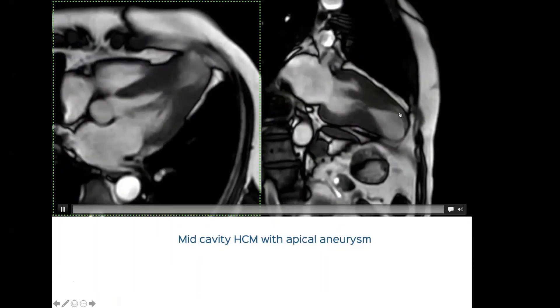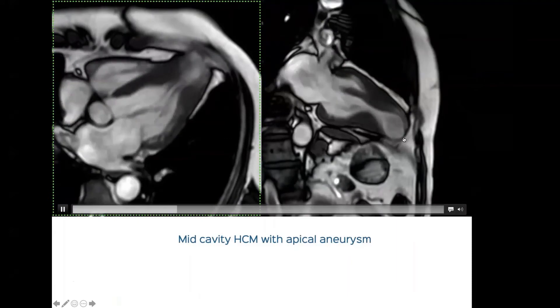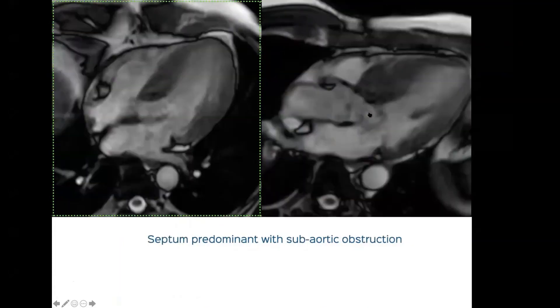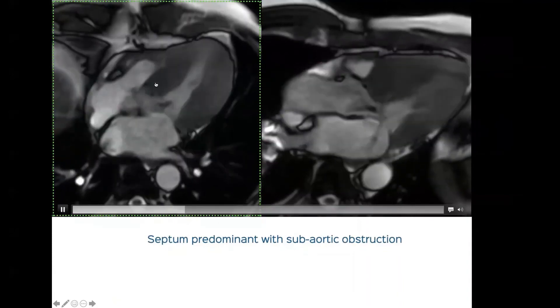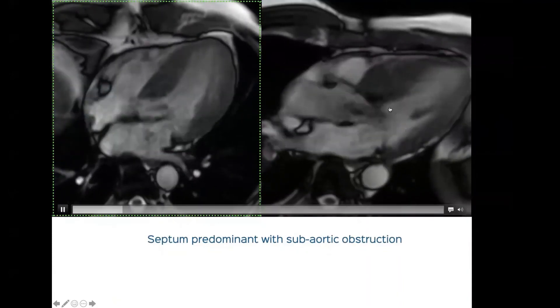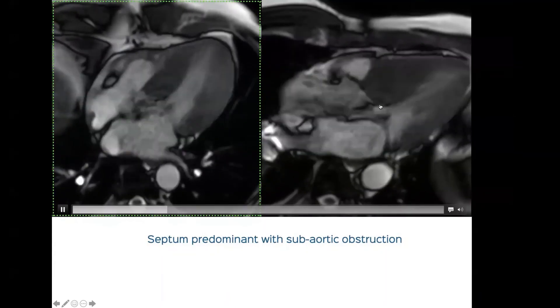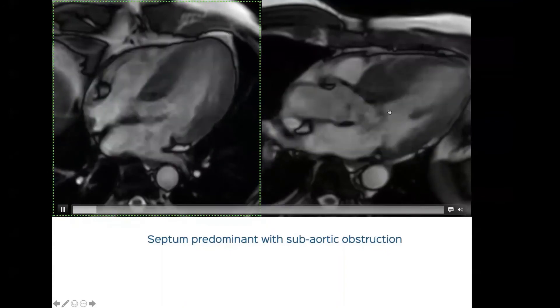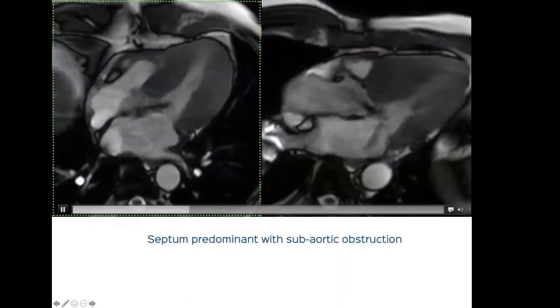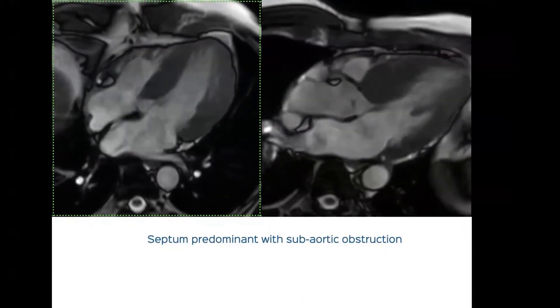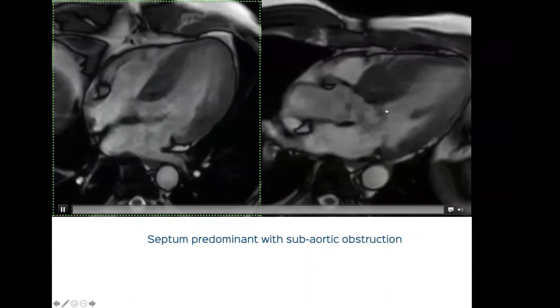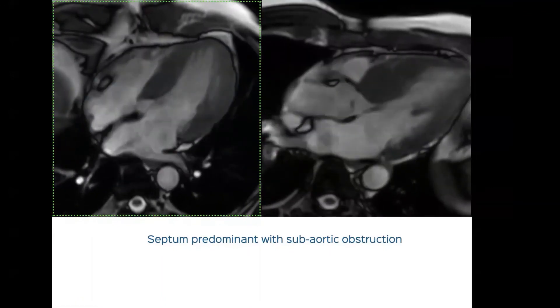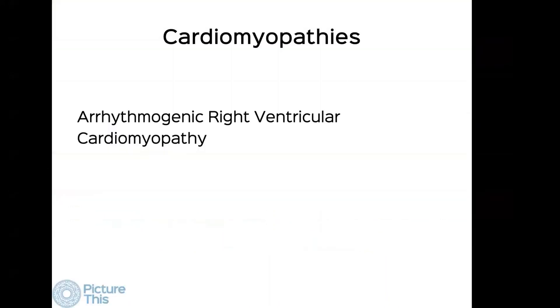On the short axis view, white areas represent fibrosis — this patient had more than 25 percent of myocardium involved, clearly at risk for sudden cardiac death. Here is another type with mid-cavity HCM, mid-cavity obliteration, and an apical aneurysm with akinesia and thinning, likely due to ischemia from this classic mid-cavity configuration. Another patient has septum-predominant HCM with late systolic apposition of the anterior mitral valve leaflet to the septum and subaortic obstruction. We don't measure the extent of LVOT obstruction precisely — we just note whether it is present or not.